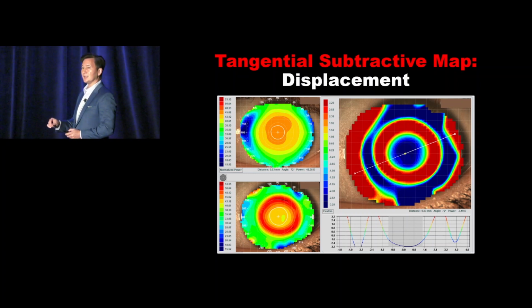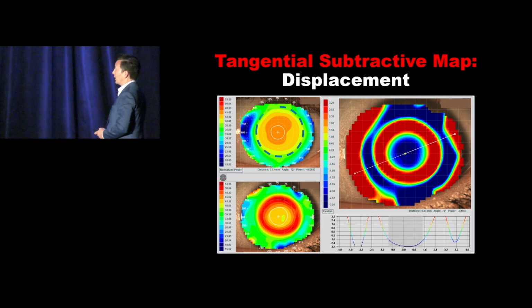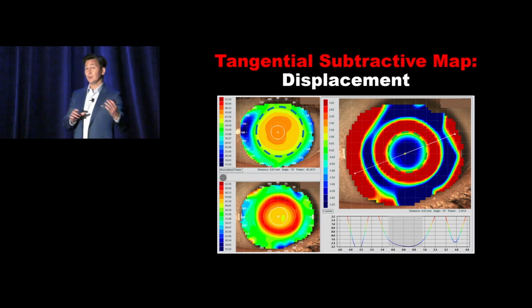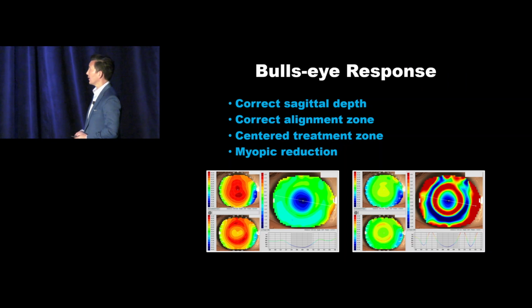The axial is anything related to vision or power. So again, we might look at the baseline eye and look at that green-yellow ring. Where is it in relationship to the pupil? And that's often where your findings will be post-wear. So you can use that displacement of the baseline eye to understand where the lens is going to be post-wear.